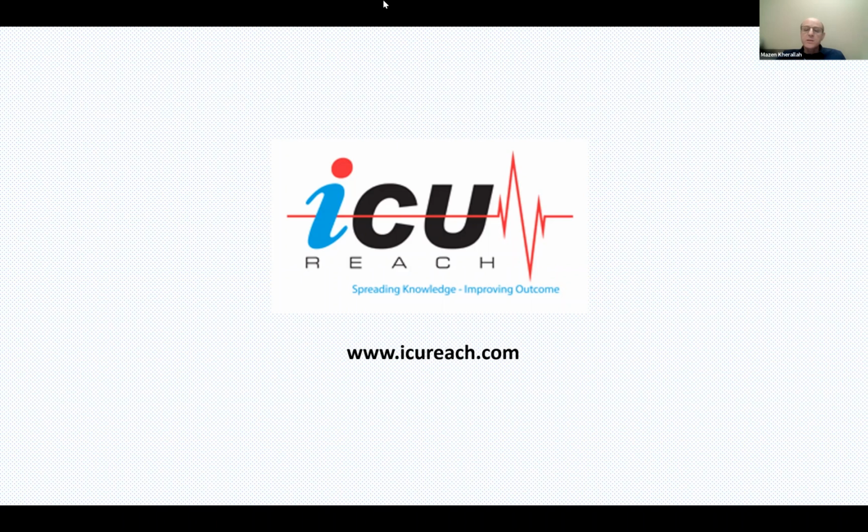If you hold it in expiration, you're letting the patient exhale first, and then you're holding the system, and then you're looking at any inspiratory efforts that are done during that period. In inspiration, you're holding after the patient inhales. So you're not letting the patient exhale here. You're holding within inhalation, within inspiration.